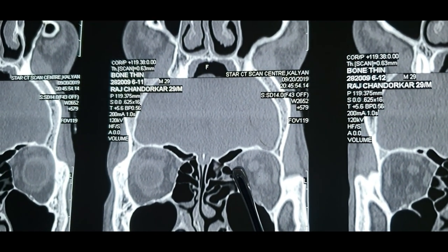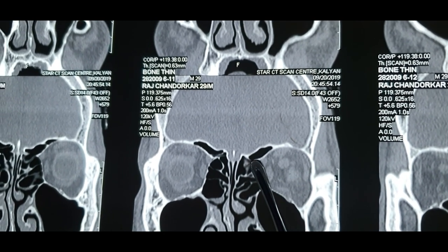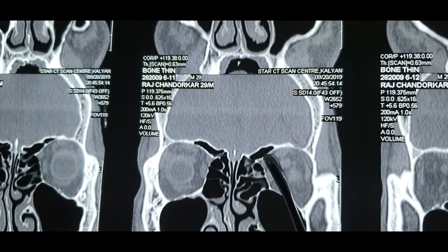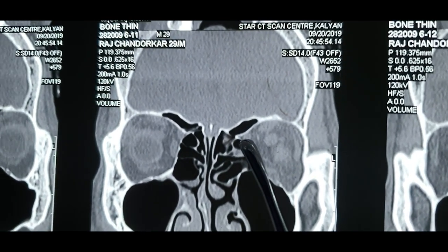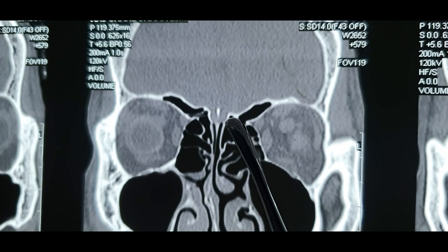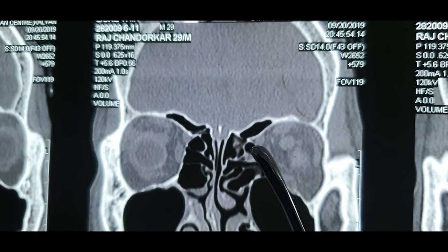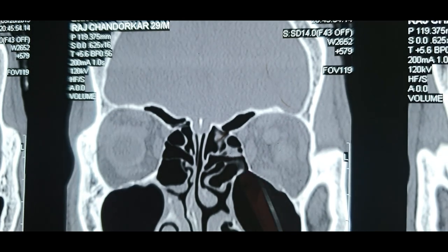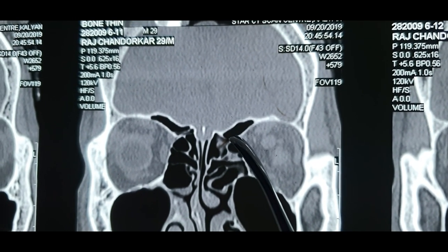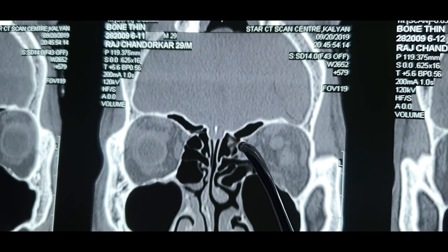This is called the confluence of the medial rectus with the superior oblique. At this very confluence, you see a bony projection coming into the picture. That bony projection is nothing but the exit of the anterior ethmoidal artery from the orbit into the nasal cavity and into the cranium. This is called the Kennedy nipple sign, because it gives a nipple-like shape, like the nipple of a baby's bottle. So this is the Kennedy nipple sign, and this is the anterior ethmoidal artery at this level.